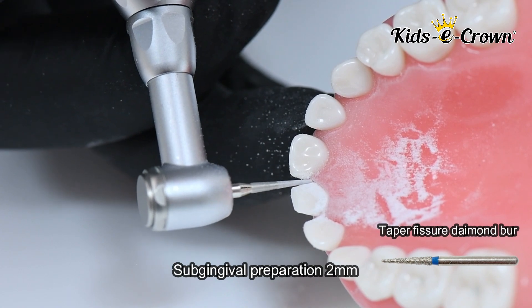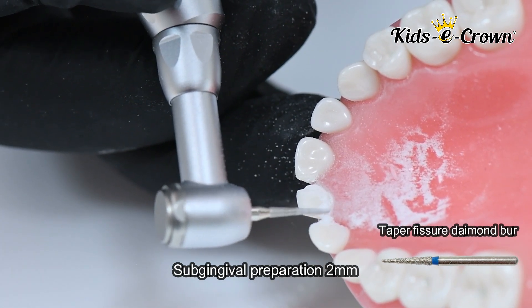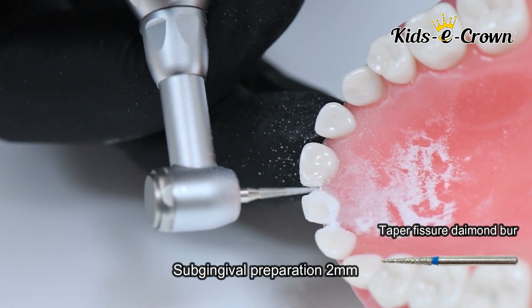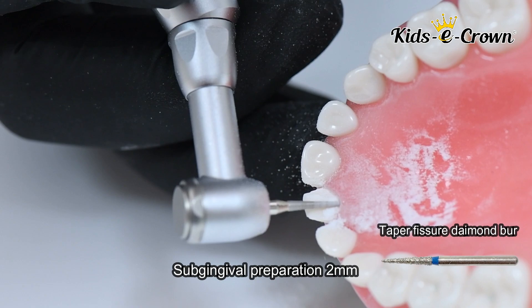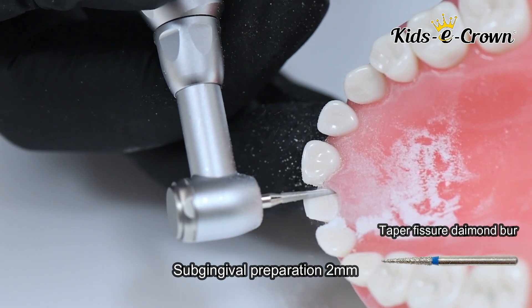You check for ledges in the sub-gingival area and, with the help of the same tapered fissure burr, you can remove them. At the end of your preparation, the finish line is essentially a knife edge or feather edge, which is not visible with the naked eye.